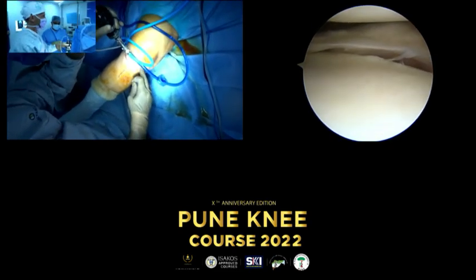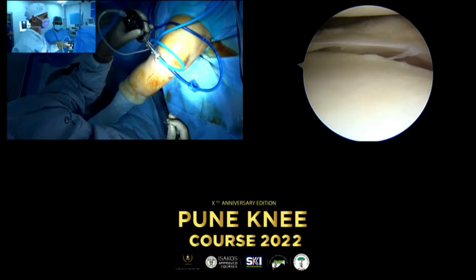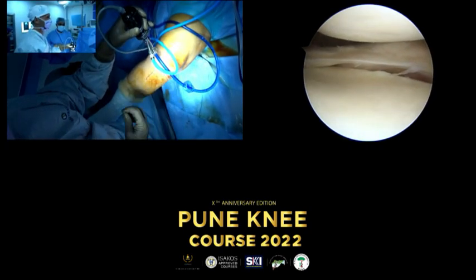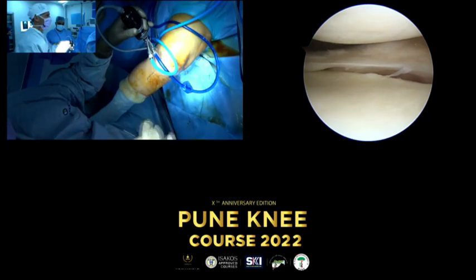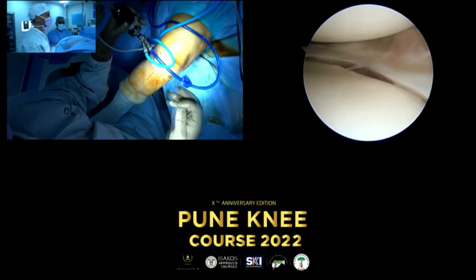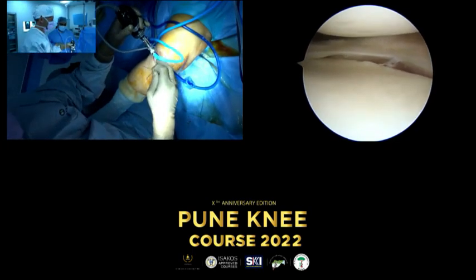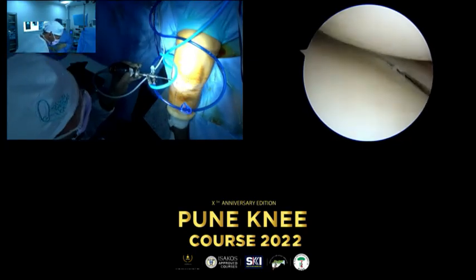And is that because you can adjust by making sure that the horns go into the bone? Exactly, that's the advantage of only soft tissue. The problem with the bone plug technique is you have to be really accurate, you have to rely a lot on the bone tissue. Even so, in some cases, because of the suture and the lax capsule, you finally put the meniscus a little bit extruded, and the anterior horn will not reach the anatomic position. That's why I always request a bigger one. If it is still big, I put some of the meniscal tissue inside the anterior tunnel. And the anterior tunnel I will do, as I commented before, at the end.